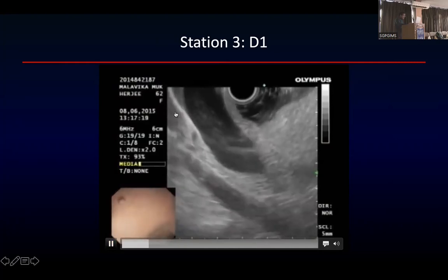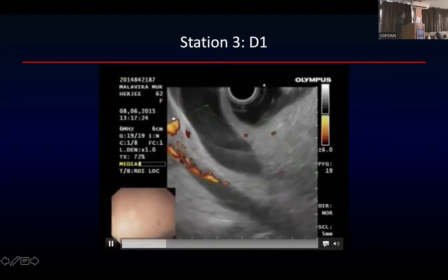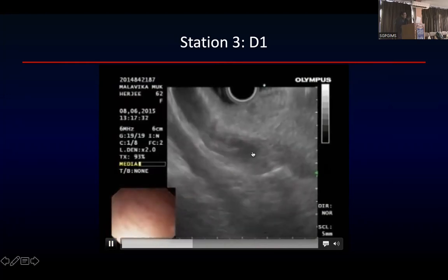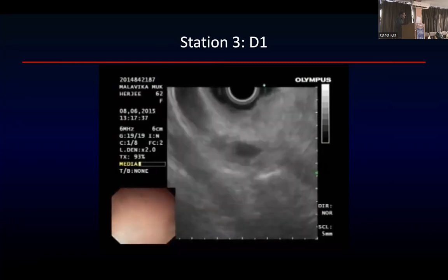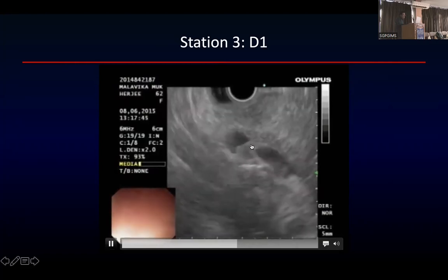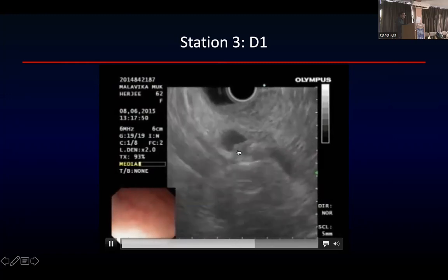इसके पीछे पोर्टल वेन आती है, very important. Bile duct nearest to the probe, further from the probe will be portal vein. And if you just trace this, बाइल डक्ट को लोअर एंड की तरफ ट्रेस करने के लिए क्लॉकवाइज मूवमेंट ऑफ द स्कोप होता है ना. जीबी देखने के लिए D1 से एंटी क्लॉकवाइज मूवमेंट होता है. तो इसको अगर आप ट्रेस कर रहे हैं तो ये छोटा सा मैस आपको नजर आ रहा है लोअर एंड पे. Okay, this is a very small mass.